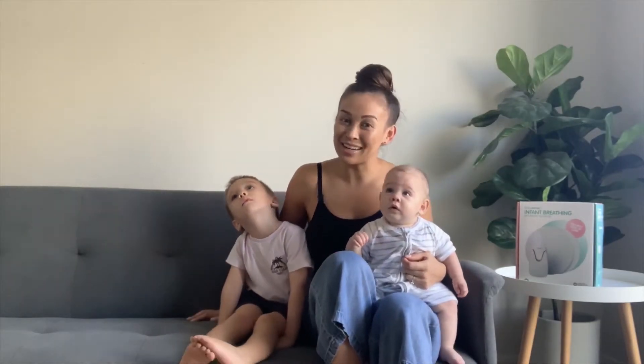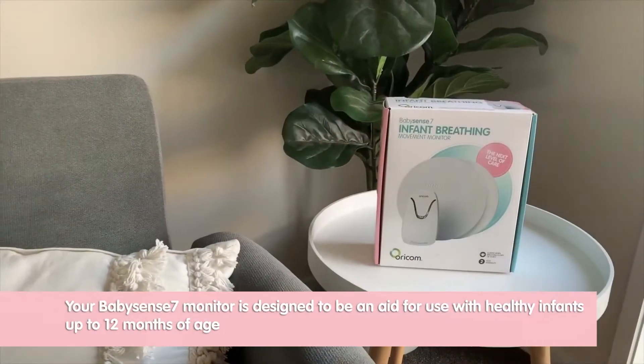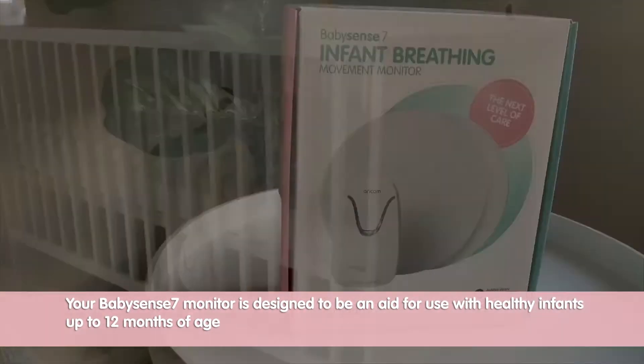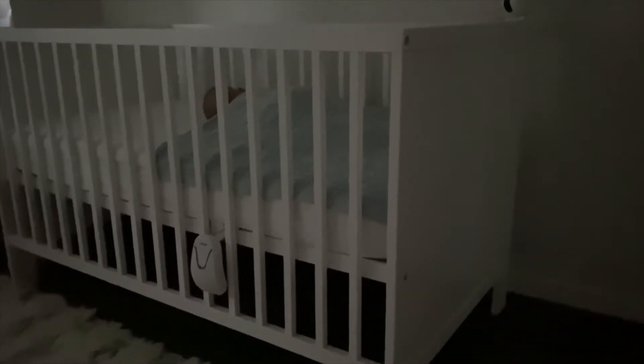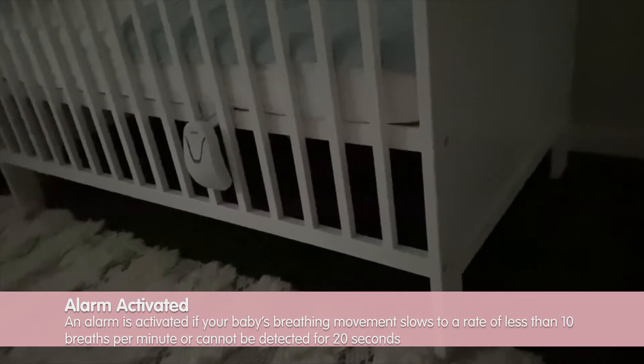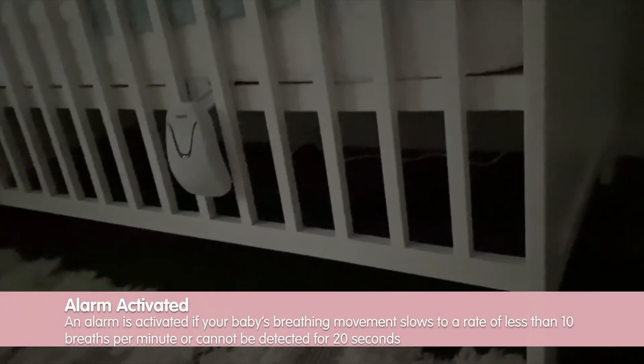Let us take you through what it does — its easy install and operation. Essentially, it continually monitors the breathing rate of our baby while he sleeps. An alarm is activated audibly and visually if his breathing movement reduces to a rate of less than 10 breaths per minute, or no breath is detected for more than 20 seconds.